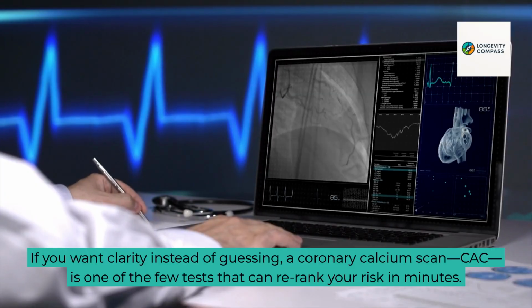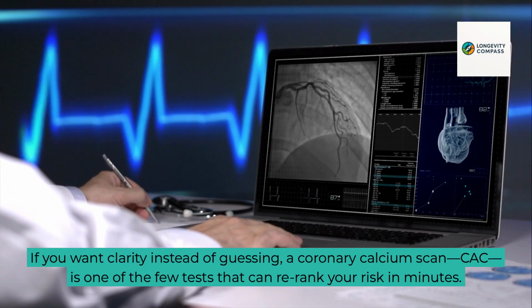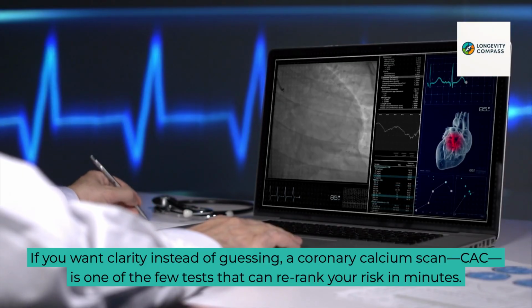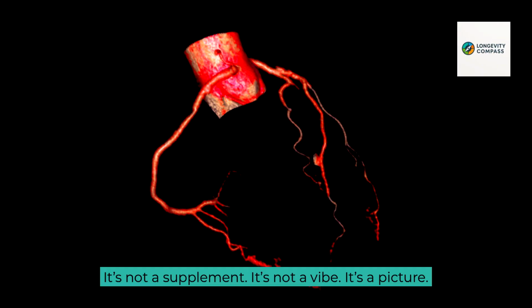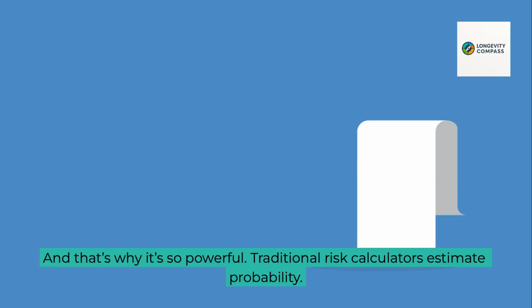If you want clarity instead of guessing, a coronary calcium scan, CAC, is one of the few tests that can re-rank your risk in minutes. It's not a supplement, it's not a vibe, it's a picture. And that's why it's so powerful.